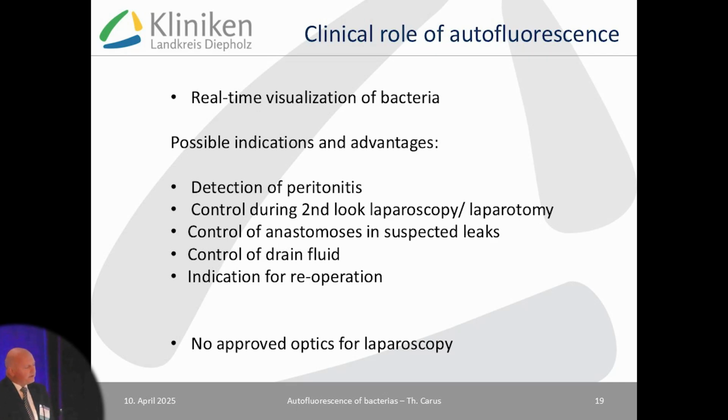For really severe patients on the ICU, you have fluid in the drains. You could take a sample or put the drain back and put it to the cameras to see whether there are bacteria in this drain or not. That could lead you to indication or no indication for reoperation.